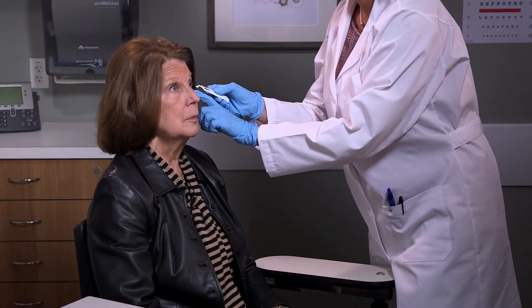If the fleece is not saturated, dab and drag the sampling fleece an additional four to six times.